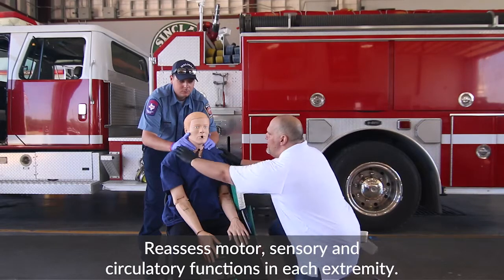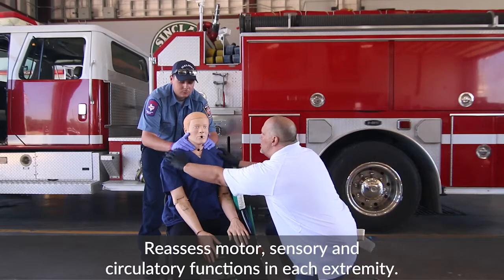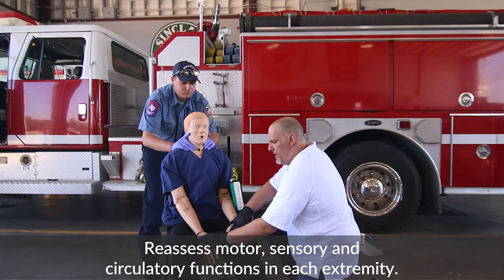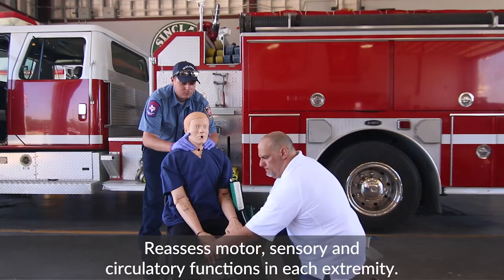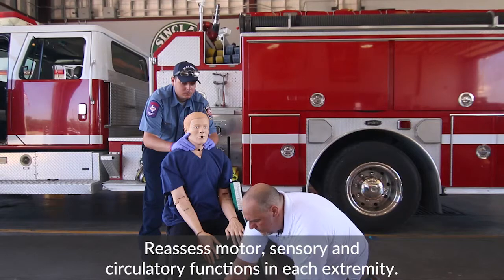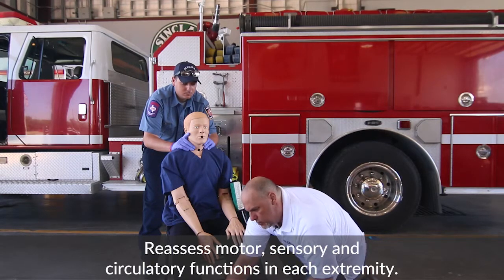Tell the patient, 'I'm going to touch you to make sure that you can feel.' Let me know when you feel me touching you. You're going to work your way down and check pulses bilaterally. 'Go ahead and wiggle your fingers for me. Let me know when you feel me touching your legs.' As you work your way down: 'Go ahead and wiggle your toes. Go ahead and lift up your foot. Push down.' Check good pedal pulses — I have them present.